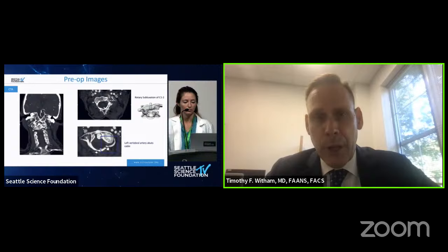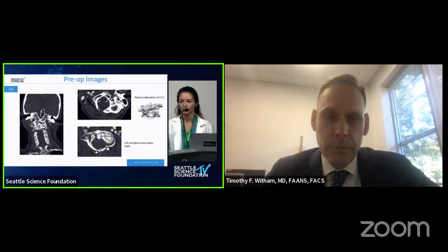This is a great segue to one of the questions in the chat room. Dr. Chinmay Padhare was really alert and asked, can we do anterior transarticular fixation? Why don't we look at your next studies, because they show us the 3D anatomy a little bit better, Amanda, and then we can pick up on that thought of anterior transarticular screws. Sure.